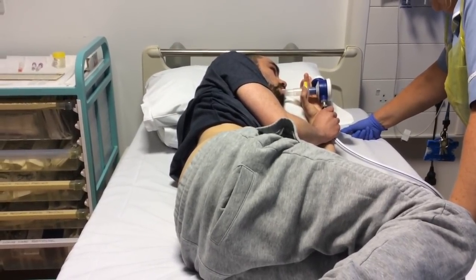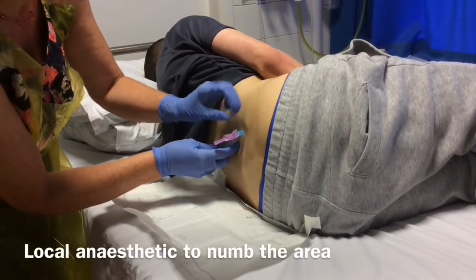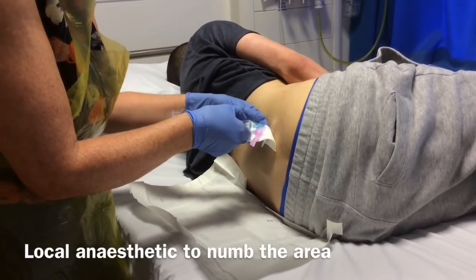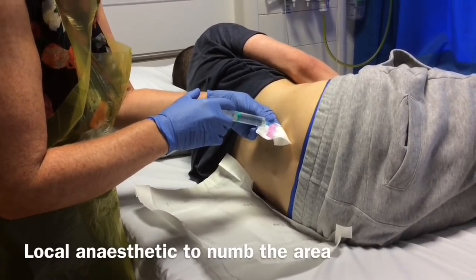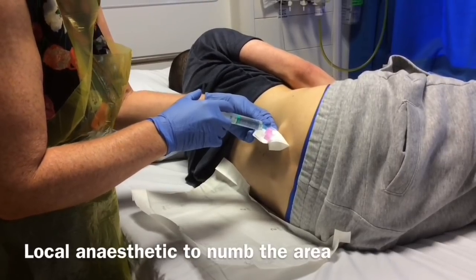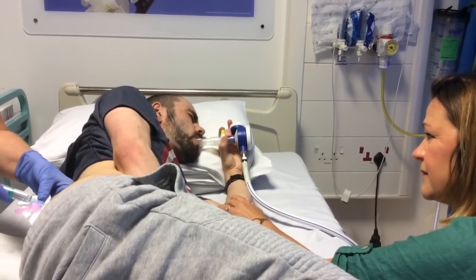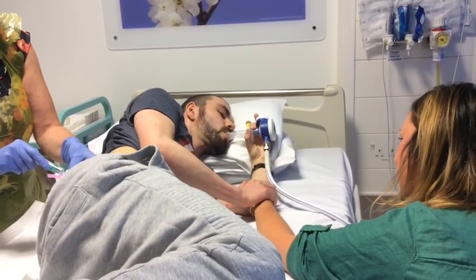Now the stingy bit — the anaesthetic going in. Nice, steady breathing. There's a bit more of that coming. Okay, keep going. That's really good. Well done. Most people say, oh, should I have got the laughing gas? It's good breathing, keep staying where you are. You're back towards me. That's okay. Very good.